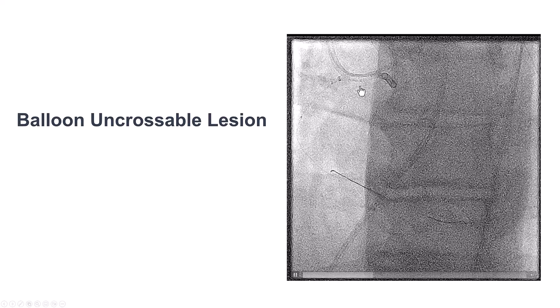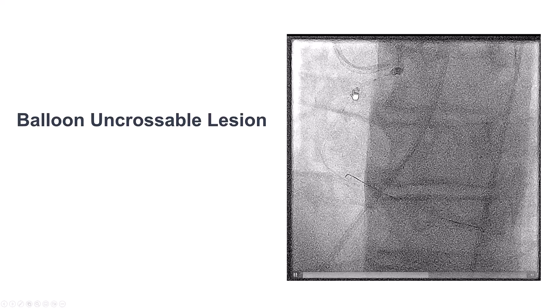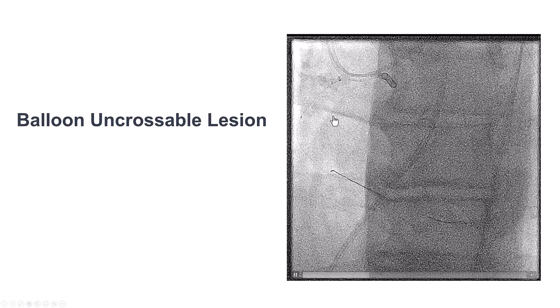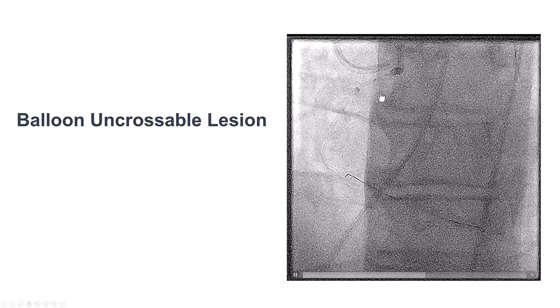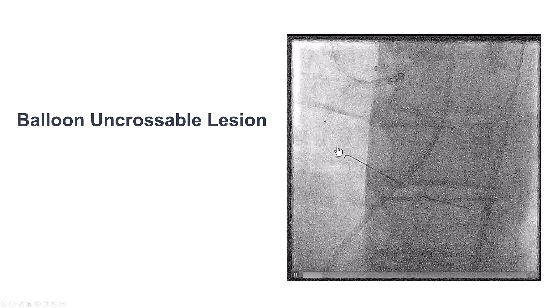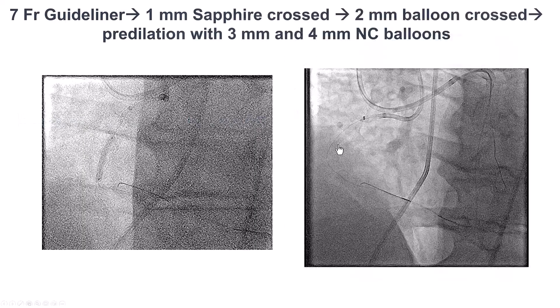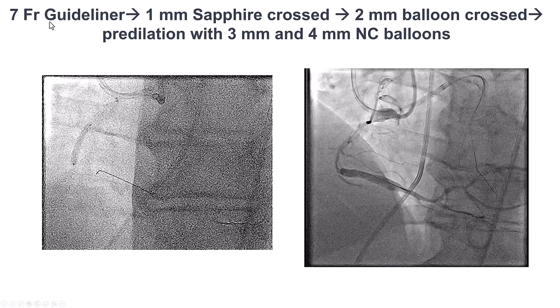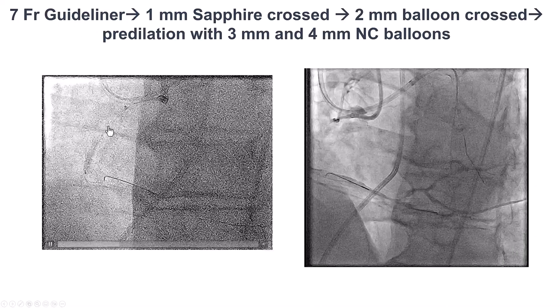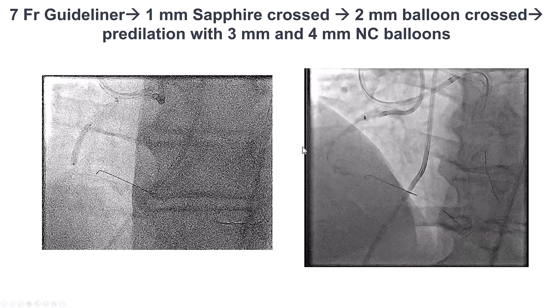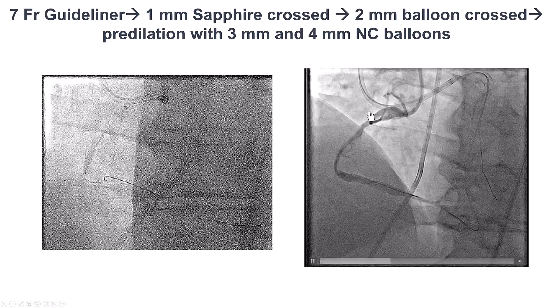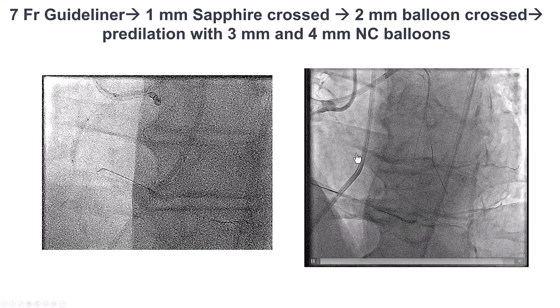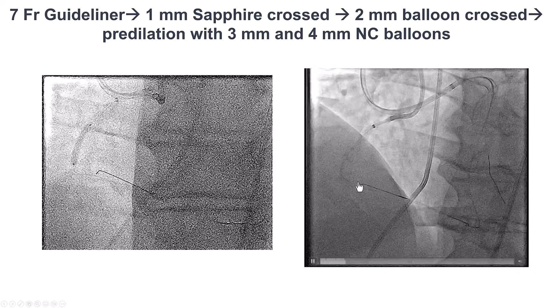The problem now was difficulty advancing a balloon — we could not cross through the mid-RCA. Eventually, after using a Sapphire Pro balloon as well as a 7 French Guideliner, we were able to advance equipment and serially pre-dilated the lesion with up to 4.0 mm non-compliant balloons.